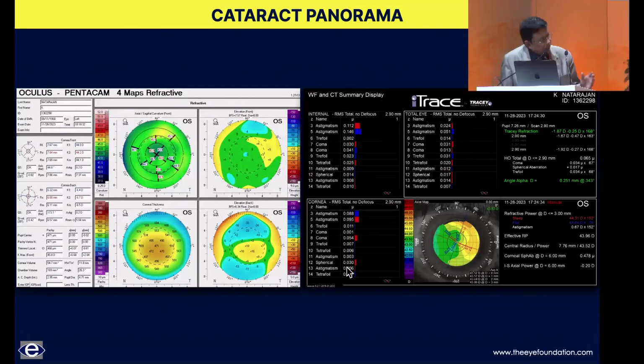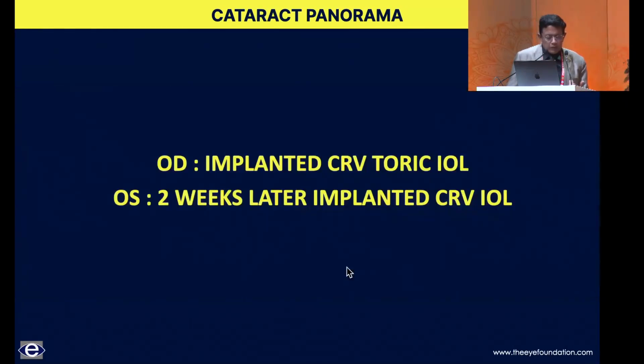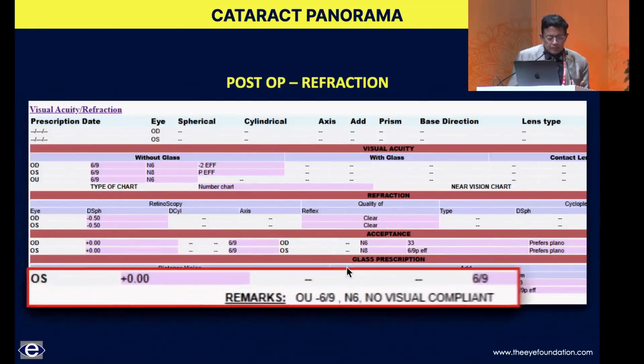We don't have the light adjustable lenses, but we still have the cornea and the laser machine. So I always counsel all my patients that going in for a premium intraocular lens, a touch-up procedure may be needed 3 months, 6 months down. Even in these cases, I make sure that there's enough cornea for me to do a PRK procedure if there's a residual cylinder or power, because invariably there could be fallacies as far as the IOL power calculation is concerned.